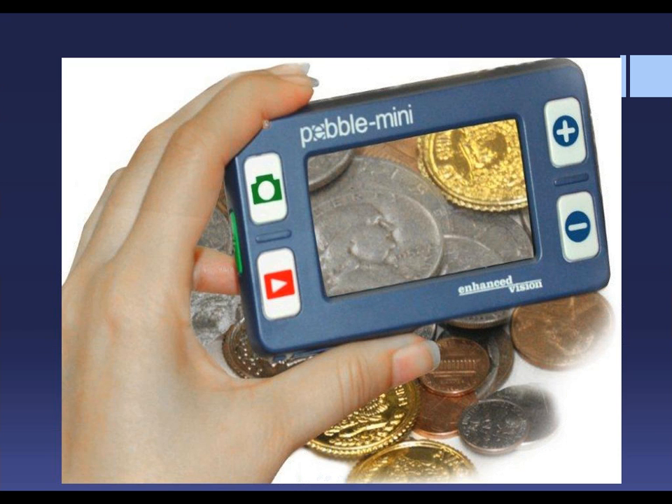Let me introduce you to the newest member of the Pebble family — this is a handheld electronic magnifier. Her name is Pebble Mini. She's petite and sleek and full of everything you want in a portable video magnifier: the ability to magnify, change background colors on the screen, take a snapshot of what you're reading and save it to your computer, freeze frame a picture, and more. It's small enough to carry in your pocket or wear around your neck. It's being used in this picture to show the detail of coin collecting.